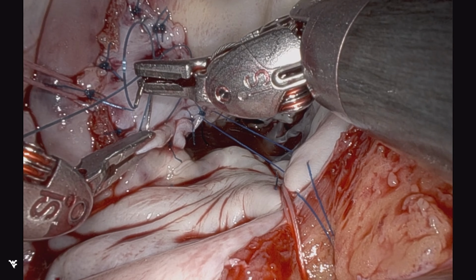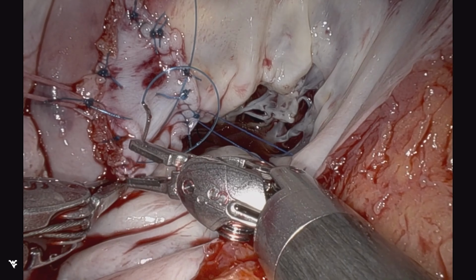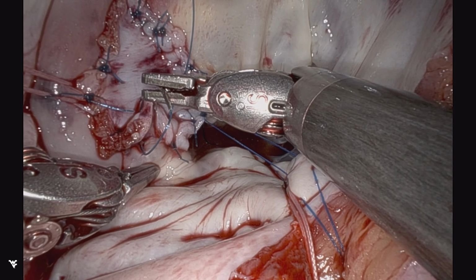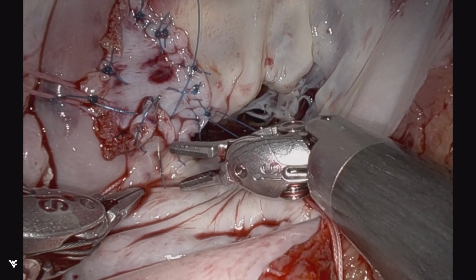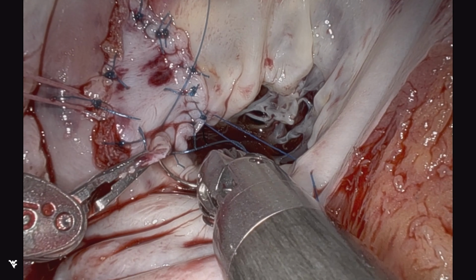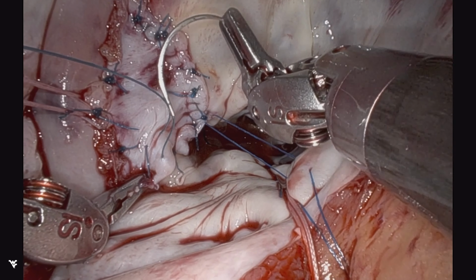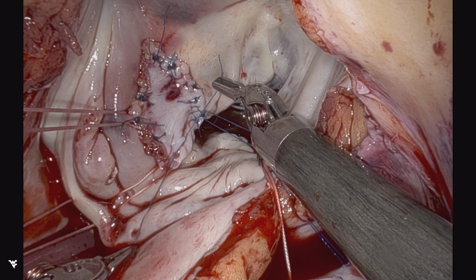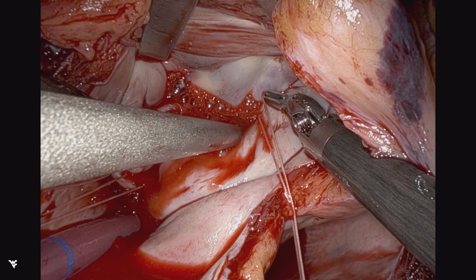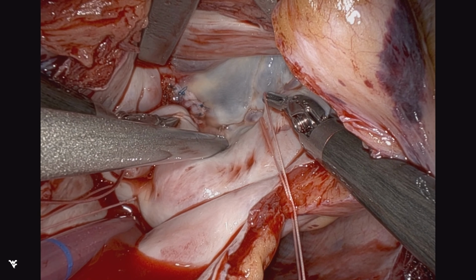And as we've demonstrated in previous videos regarding this technique, the goal here is to provide systolic competence and allow for diastolic filling. So this avoids restriction as opposed to just sewing the two leaflets together with a large gap. This somewhat normalizes the flow dynamics in these difficult cases.